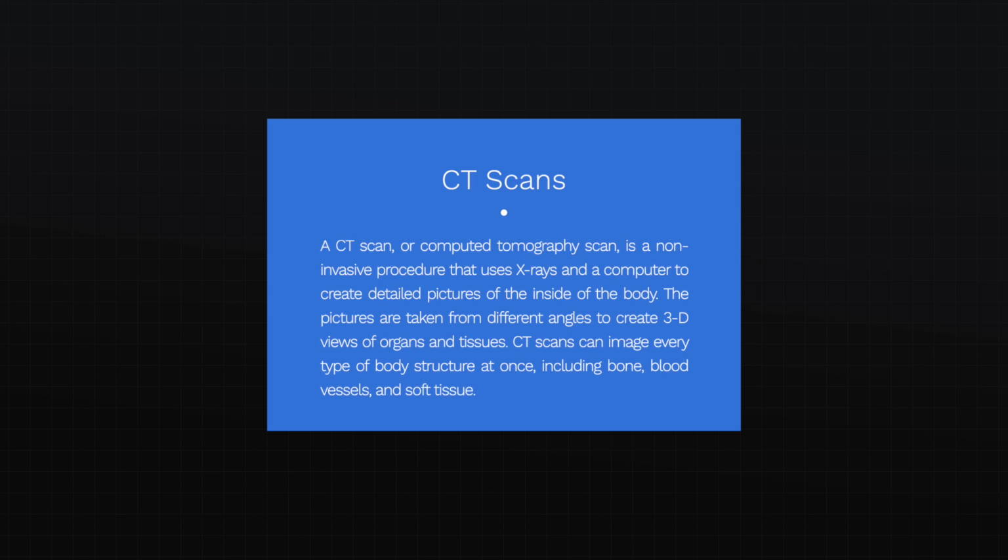So then we get into CT scans. So a CT scan can be a little bit confusing because it's also looking at the bone, but in a more detailed sense. The way I tell patients or explain it is a CT is almost like a 3-dimensional X-ray. It's giving you more of a 3-dimensional picture, but still looking mostly at the bone.